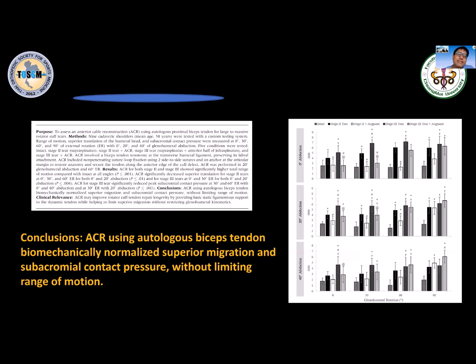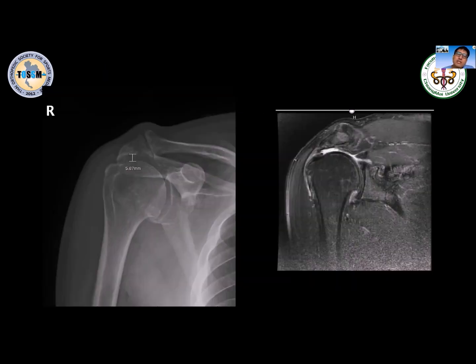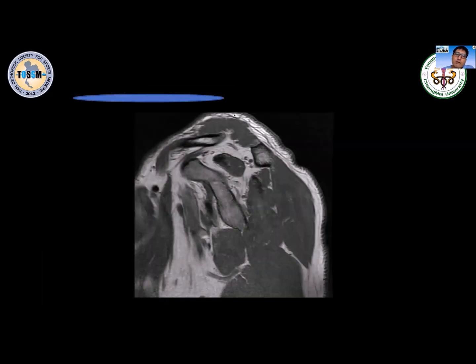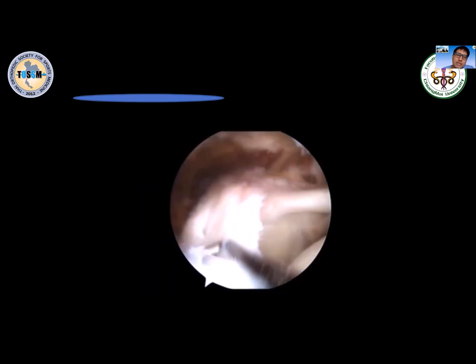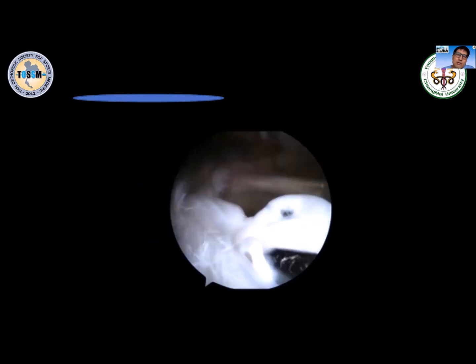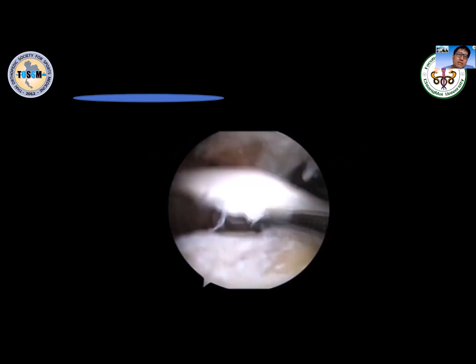I will show you the case. This is a male, 68 years old. He hurt his shoulder 3 years ago, and he can't lift his shoulder that far and has some stiffness. This is what the X-ray looks like, narrowing of the acromiohumeral distance. Yeah, I show that it's up there. Atrophy of the supraspinatus and some of the subscapularis. So this is the infraspinatus in the back. This shows that the infraspinatus is not too bad, and this is the bicep.